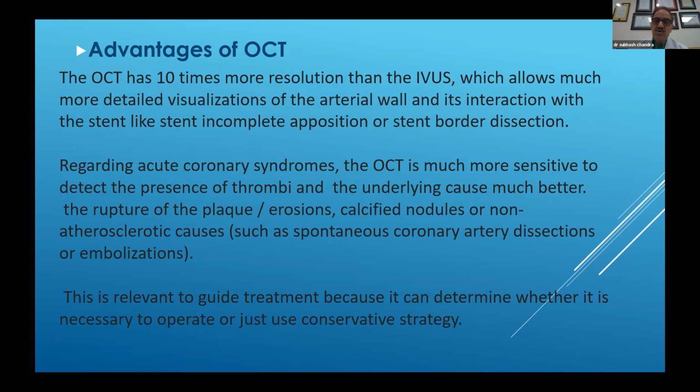In acute coronary syndromes, OCT can give you exact definition whether the acute coronary syndrome happened because of plaque rupture or erosion, or there's a calcified nodule, and what should be the strategy to treat these patients, whether just leave them alone in medical management or do something. And if it is a calcified nodule, which atherectomy device should be chosen to reconstruct the bed. And finally, it is the relevant guide to the treatment and helps determine the best strategy to treat these patients.